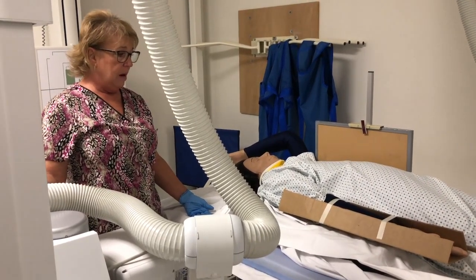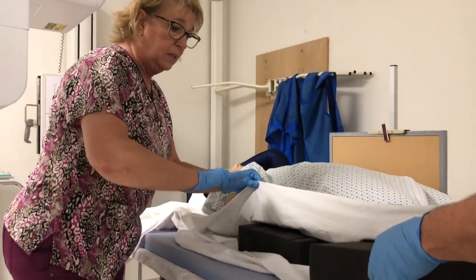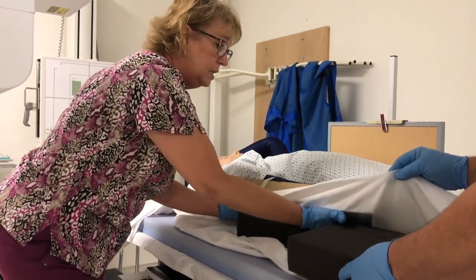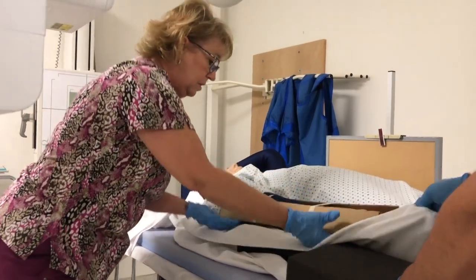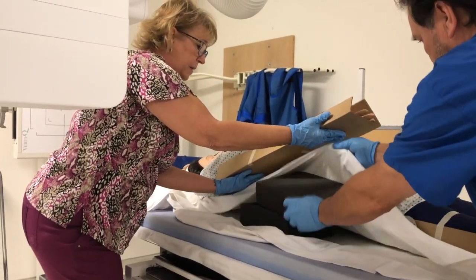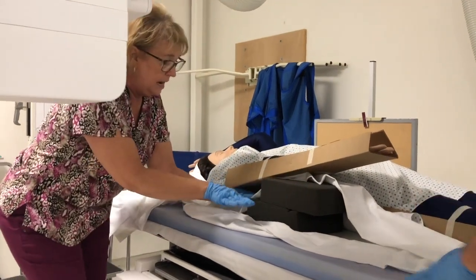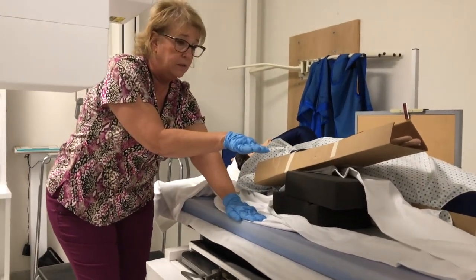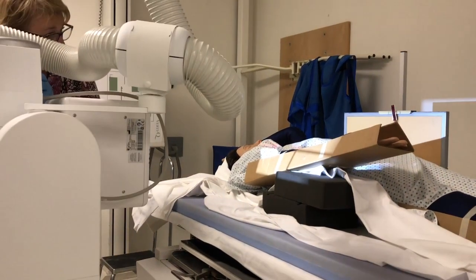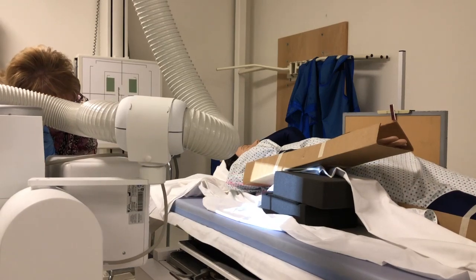Okay, now we're going to move down to the L spine. So now with the L spine, we're going back to the lordotic curve, which means I need to raise her arm even more. So I'm going to get a second sponge so that the arm is now above her L spine. Send her to the cassette. I'm at the level of her crest.